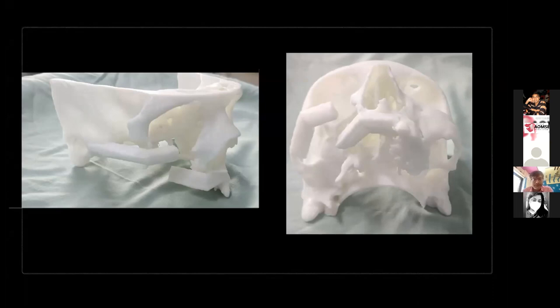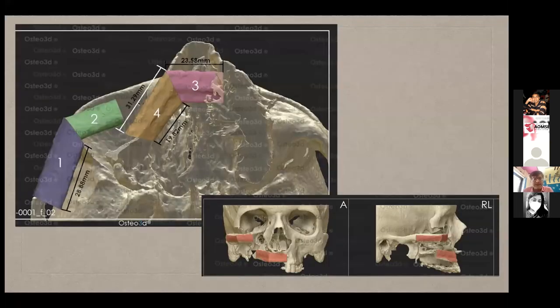As you see in the picture, it is well labeled that 1 and 2 form the zygomatic bone and 3 and 4 form the maxillary alveolar arches. The distance between segments 2 and 4 is another bone segment which is removed for the pedicle to traverse between them. The pedicle goes from the posterior region towards the neck for the anastomosis.